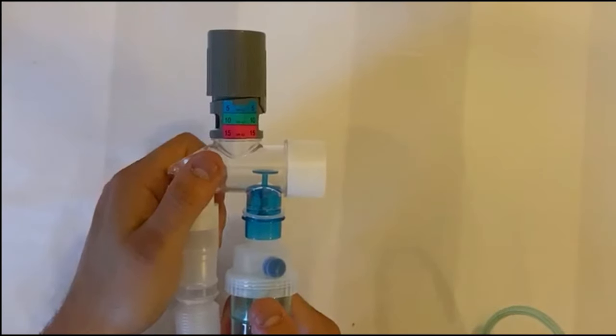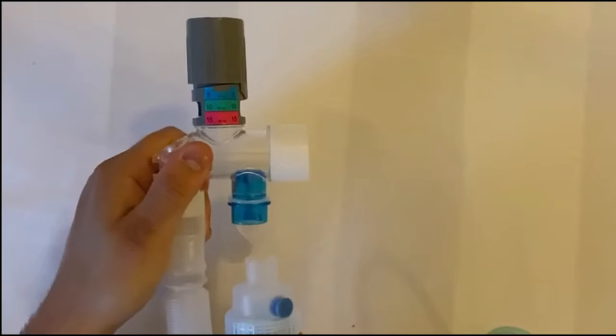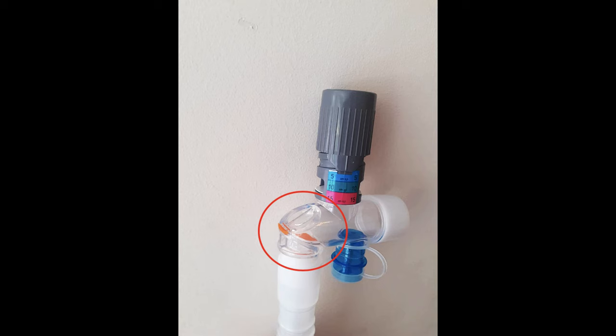If the barrel happens to be removed from the circuit, the spring valve will lower to ensure the circuit remains closed. The T-valve is also fitted with an orange anti-asphyxiation valve. This safety feature ensures that the patient is able to inhale ambient air and avoid asphyxiation should the flow fail.